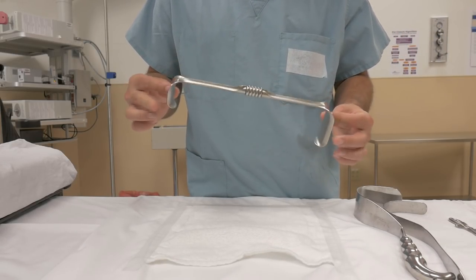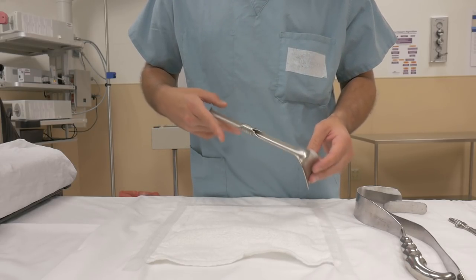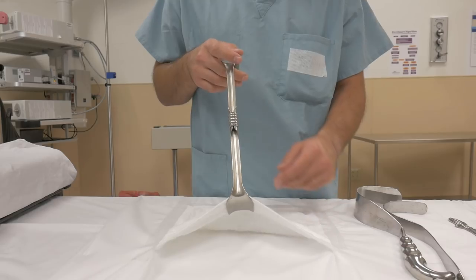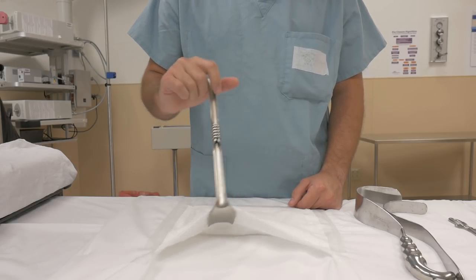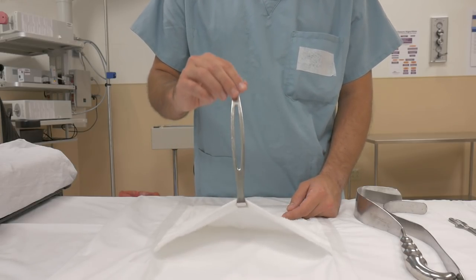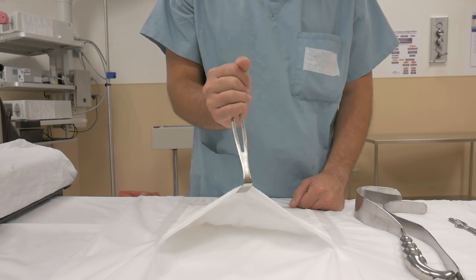The Richardson retractor comes in many different sizes, but every Richardson is going to have a slightly deeper end and a slightly shorter end, depending on the tissue you're retracting. The majority of the time I'm holding this retractor, I'm just keeping a couple fingers in the grooves on the opposite side and holding up. If you get tired, you can switch it up, put your hand underneath just like so, and hold up. Pretty much the exact same thing with the Army Navy retractor — it's got a slightly longer end and slightly shorter end. Same thing: holding it up, holding the opposite side of the retractor. If you get tired, put your hand in place and hold it up.